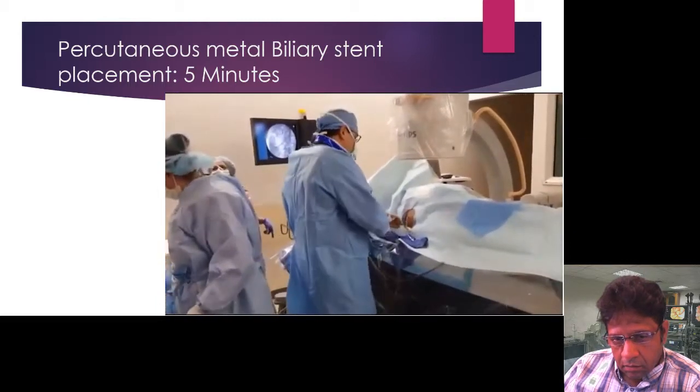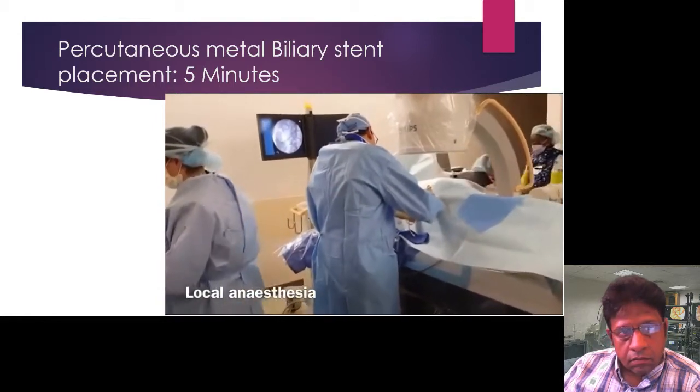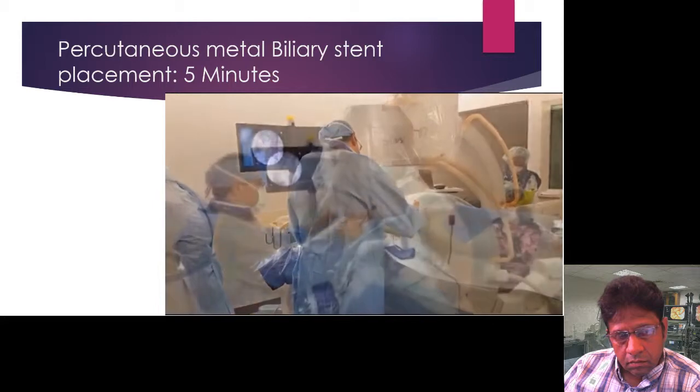So we'll start with the local anesthetic. Okay. Can you feel something here, a little pinprick? That's going to sting a bit. Good. Okay. All right.